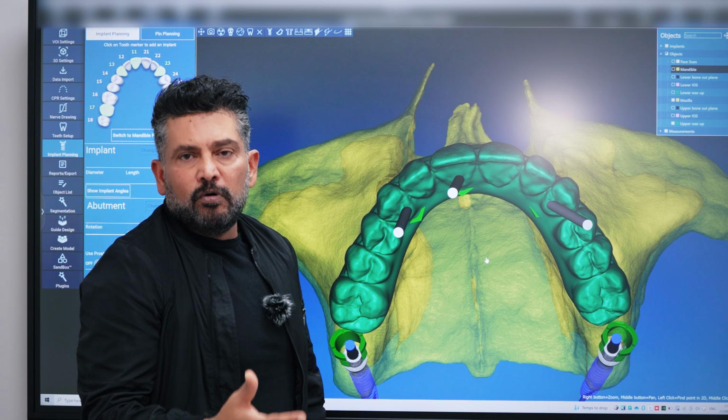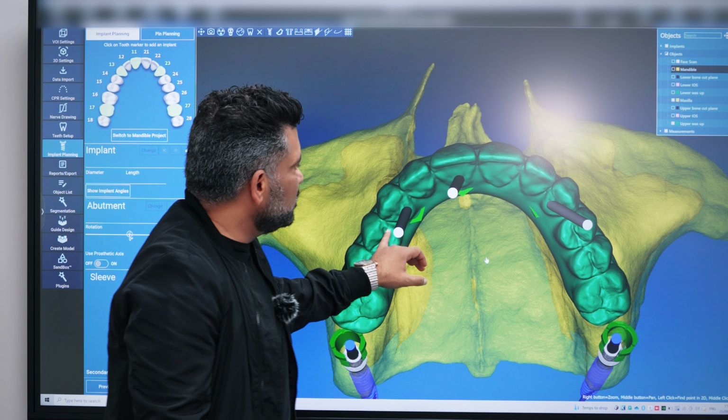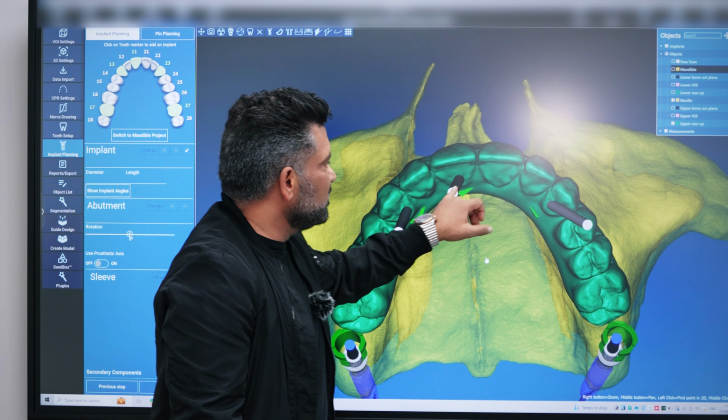So it's very important that we have the optimal positions of the implants, and to achieve that, we have to use surgical guides for this level of precision consistently. In 21D, we're doing surgeries every day, 5 days a week. Surgeries currently are done in a surgical hub in Warrington, Birchwood.